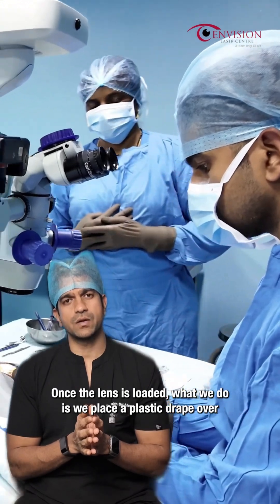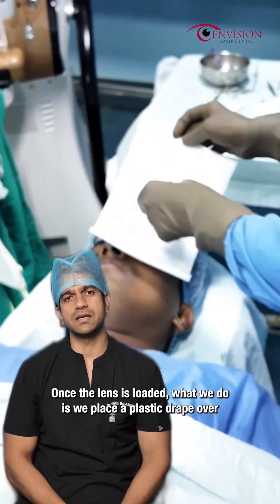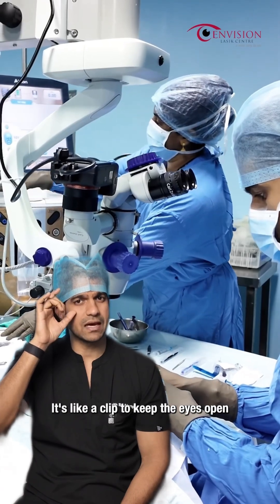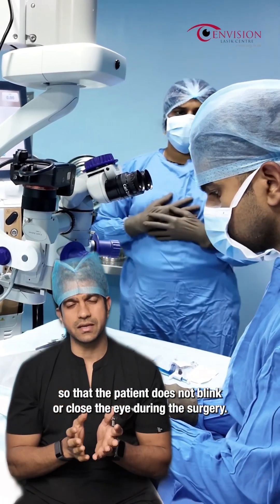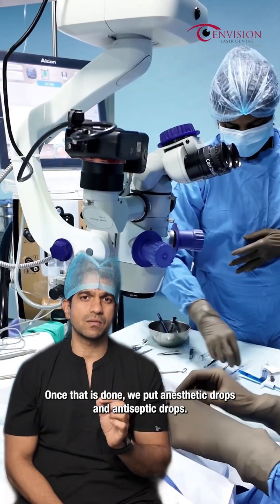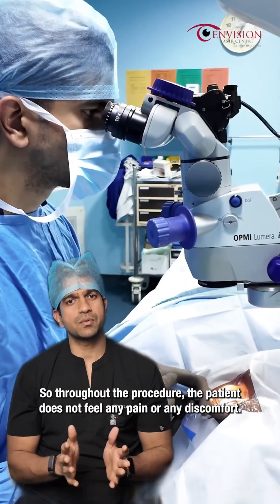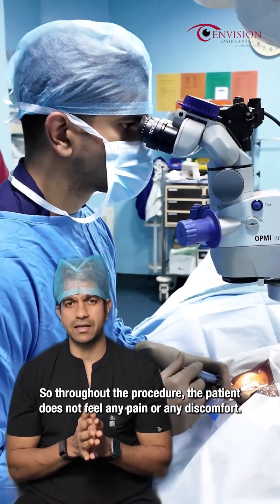Once the lens is loaded, we place a plastic drape over the patient's face and then we place a small speculum. It's like a clip to keep the eyes open so that the patient does not blink or close the eye during the surgery. Once that is done, we put anaesthetic drops and antiseptic drops. These drops will basically numb the eyes, so throughout the procedure the patient does not feel any pain or discomfort.